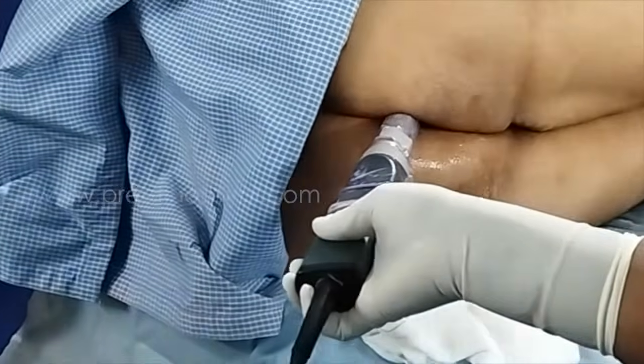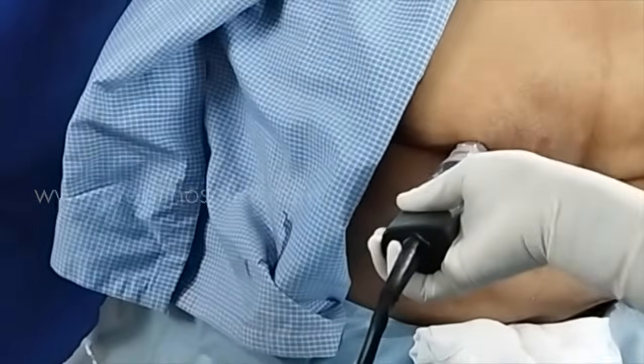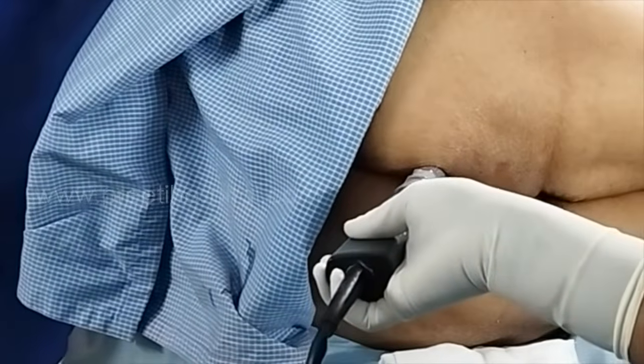This is completed on the right side. Left side completed. Keep note that 10 and 11 are left side. Write down: 10 and 11 are left side.